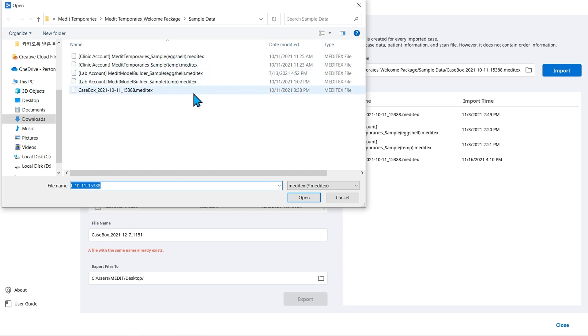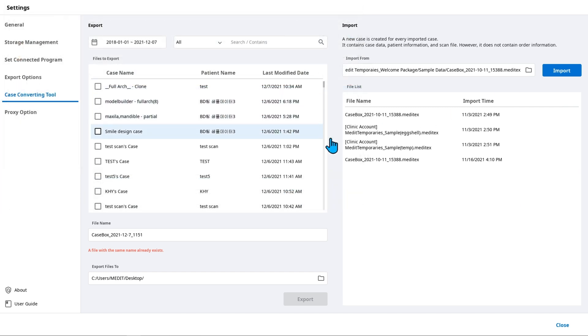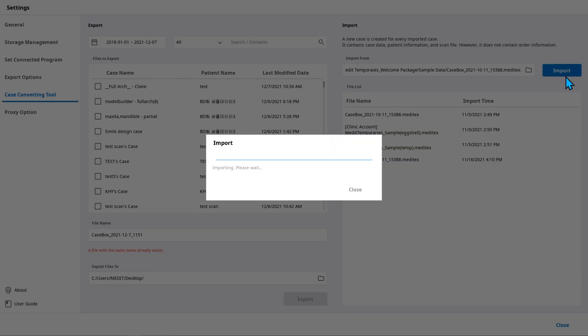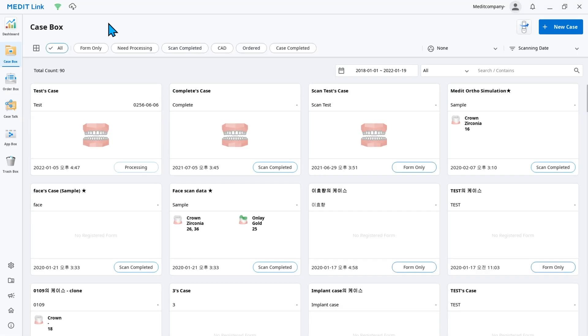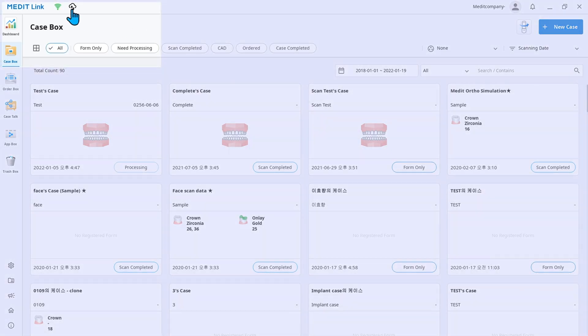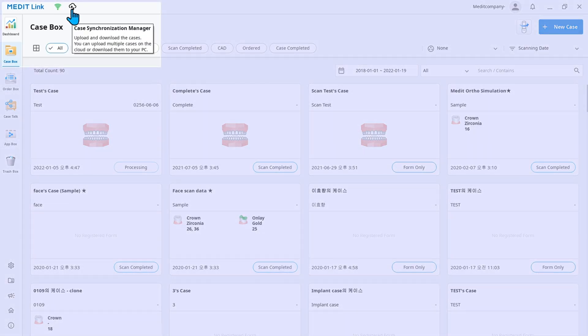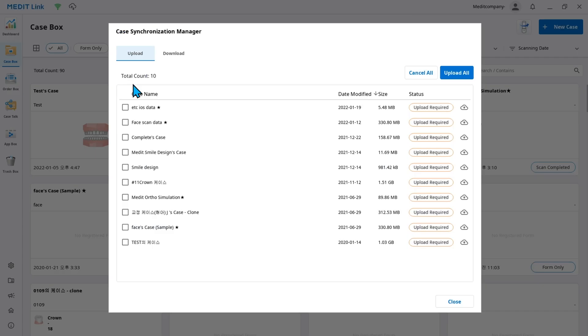Use the case converting tool to import Meditex files back to MeditLink. You can also backup files by uploading them to the cloud via case synchronization manager.